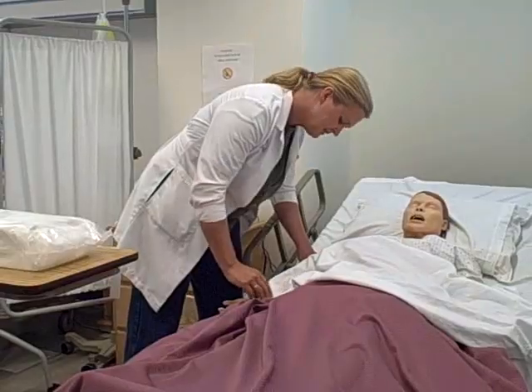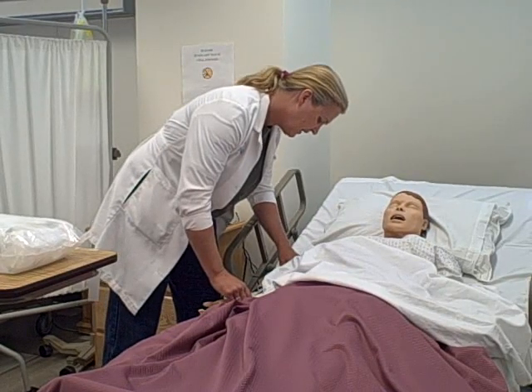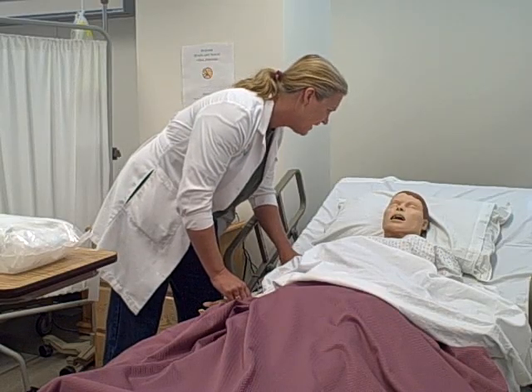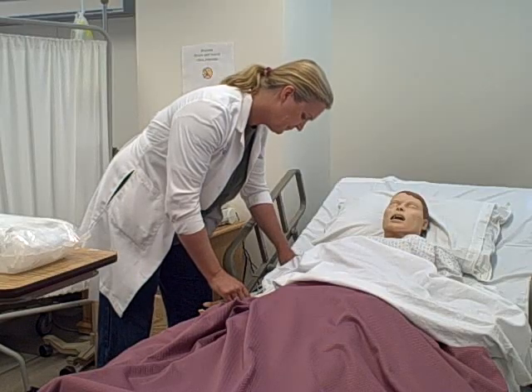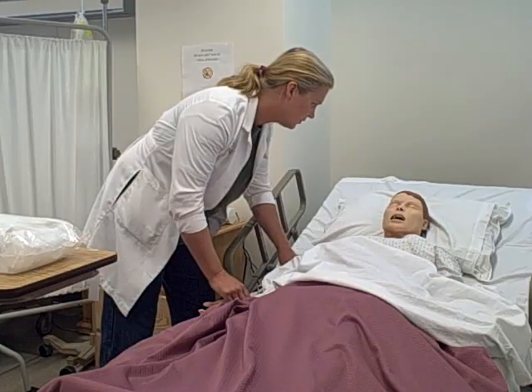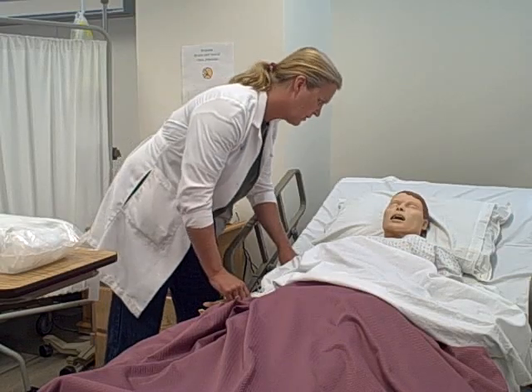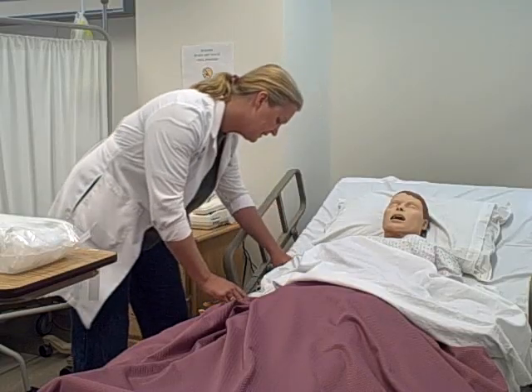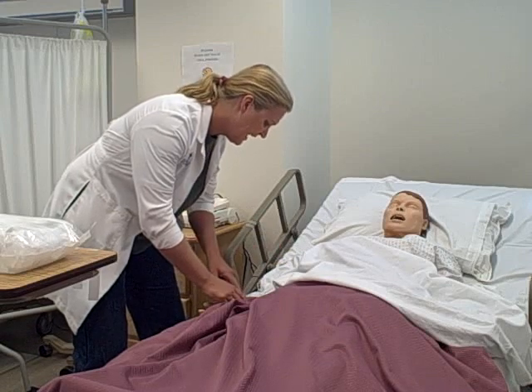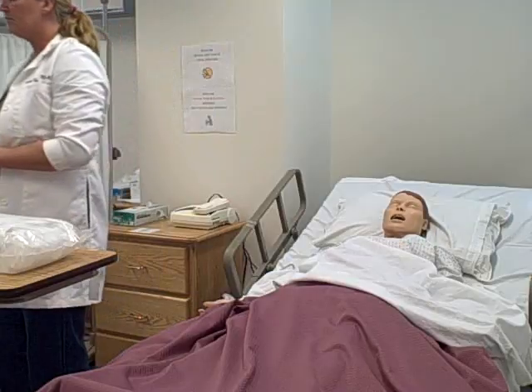Good afternoon, Ms. West. I'm Mary, your student nurse from today. Your physician was just here and discussed with you the fact that you haven't been able to urinate yet since surgery, so he's ordered placement of a Foley catheter to drain the urine from your bladder. Is that okay? Thank you. Can you give me your name? Ruth West. And your date of birth? 5-19-32. Excellent. Note that the student will provide privacy and wash her hands.